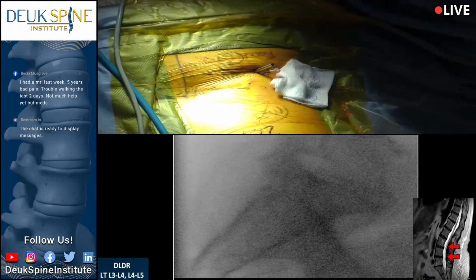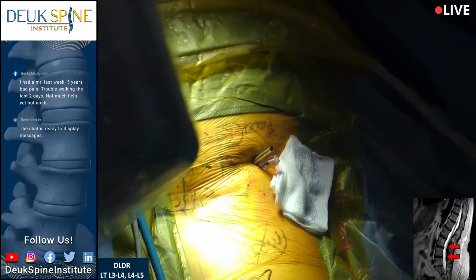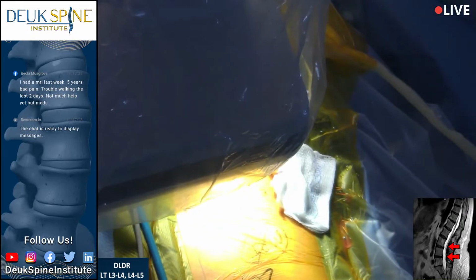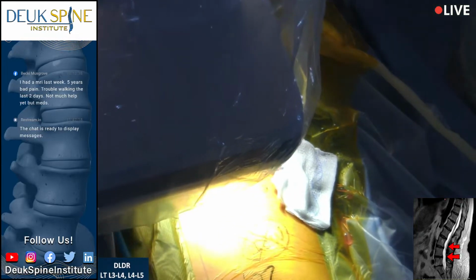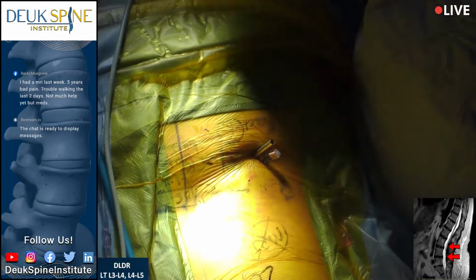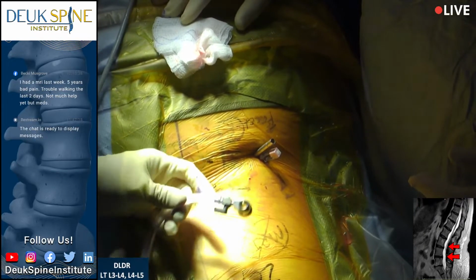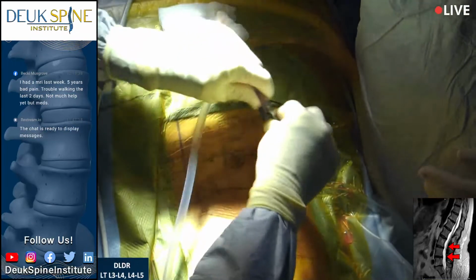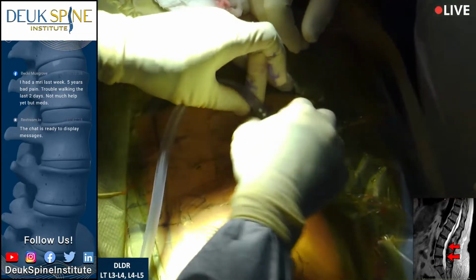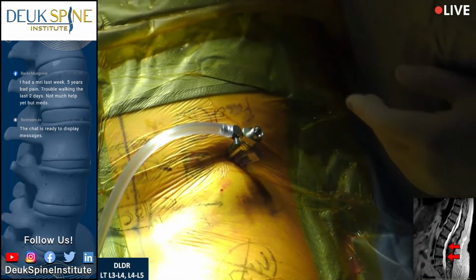You doing all right, Doc? Okay, everything's good. We're at L3-4. Everyone agree? And we're going to get this fixed, and then we'll do the next disc, and then we'll go to the plasma. For the plasma rhizotomy, Doc, at the end, we don't need her as deep, okay? You need help back there, or are you good? Yeah, it's got a lot of soft tissue, I understand.